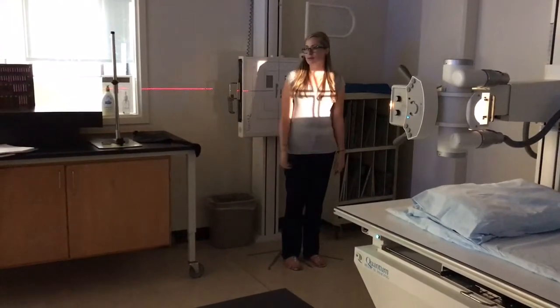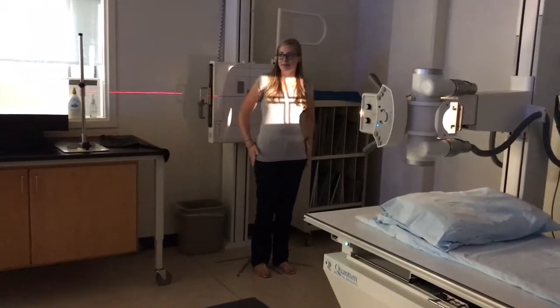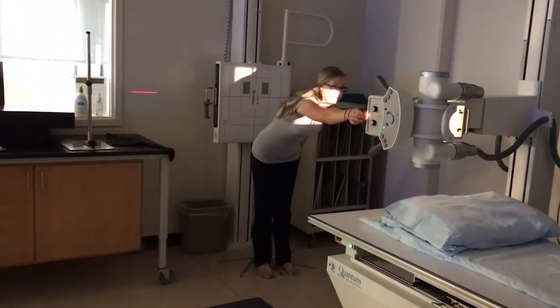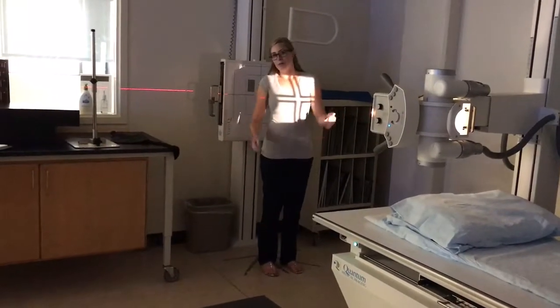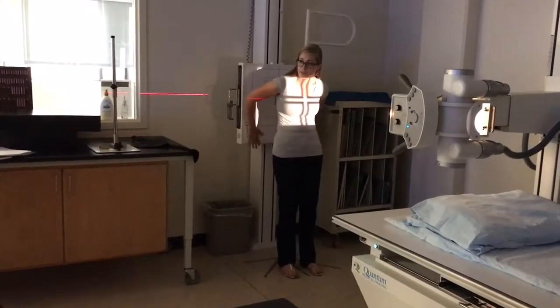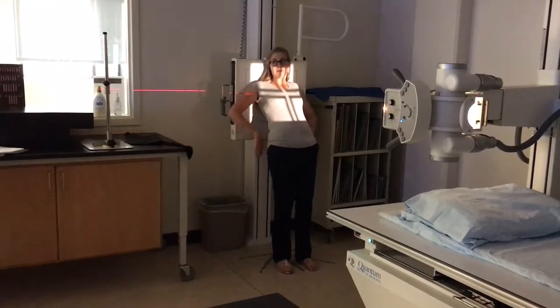The tape is for your angles — I just found out what it was for yesterday, and it might not stay. So you have them take the step away. There's a distance. Nobody's going to want to just lean, so you can let them hold on to it and lean back into their shoulders and then throw out their hips, like this.